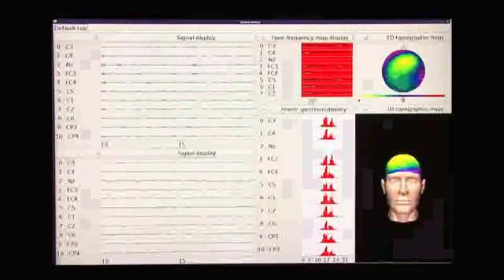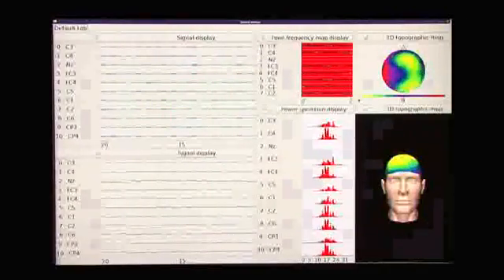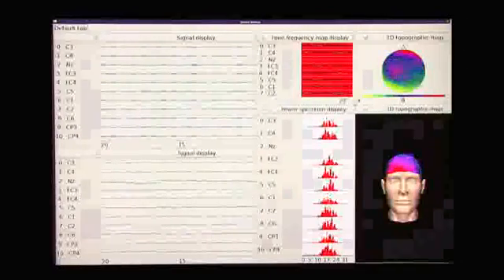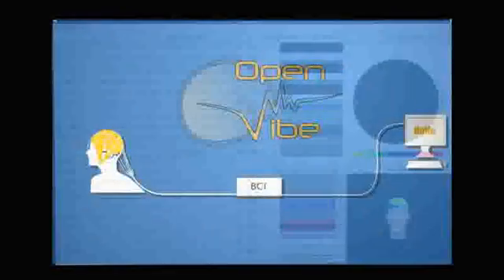OpenVibe offers many pre-configured scenarios for different applications including mental imagery, neurofeedback, P300 signals, etc.